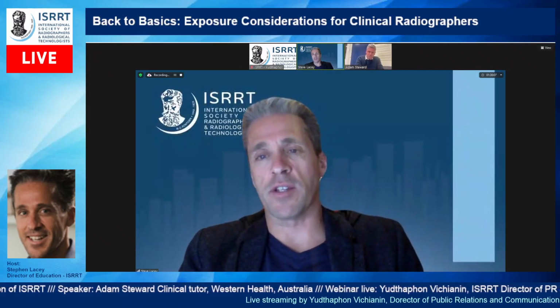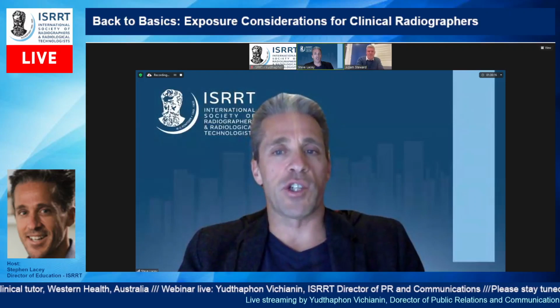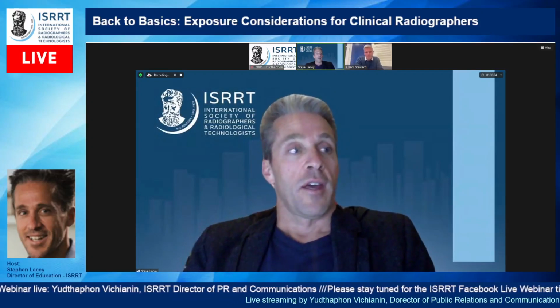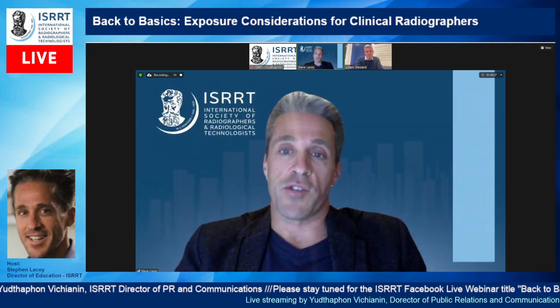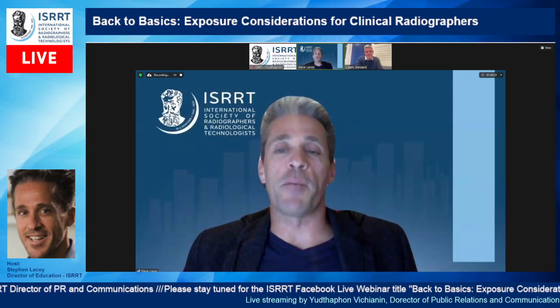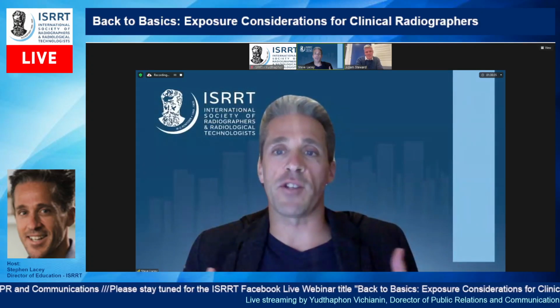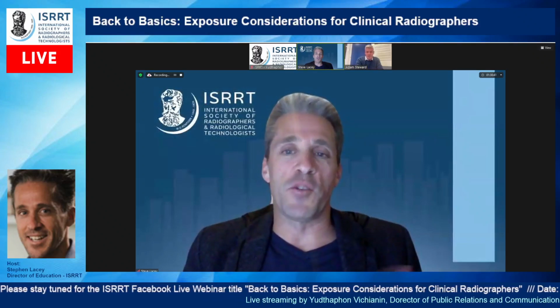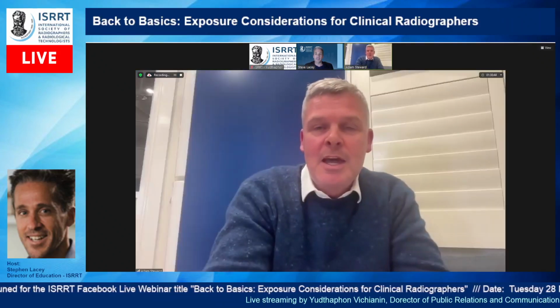Does that help? Yeah, I was going to say, if we apply this to pediatrics, when it comes to chest X-rays, we would very rarely use a grid in pediatrics, and I think it's the same concept you're talking about because of the aeration of the lungs. And to be honest, I think a lot of people use grids in chest X-rays for adults just because it's a universal thing. But when you think about some of the people you're actually X-raying for a chest X-ray in an adult centre, sometimes you probably don't need a grid, but you just use it because you do it for everyone, right?